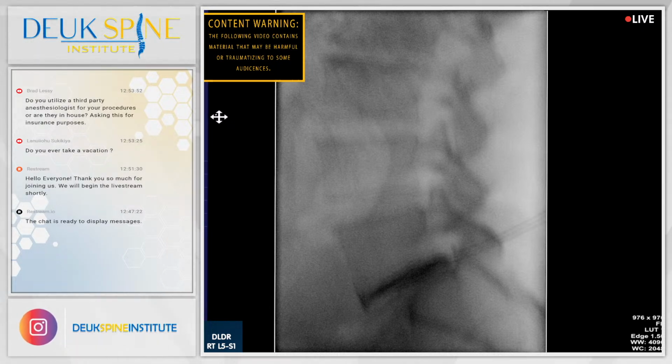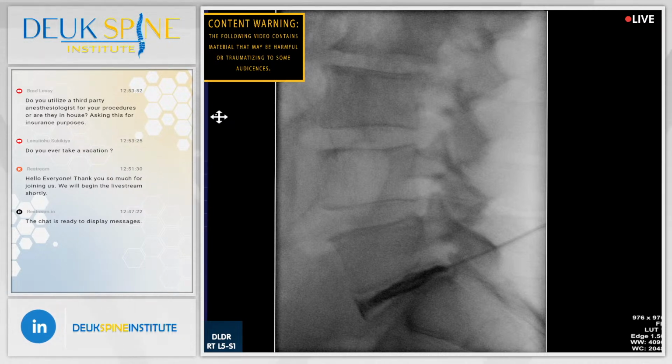Yes? Okay, good. All right, well, we woke him up. We tested the L5-S1 disc. You can see the giant tear. Jordan, show the audience the tear. Starts where the arrow is, goes all the way to the periphery. And it's his right leg that is really bad with the numbness. So we're going to get in there and remove the herniation out of the tear.